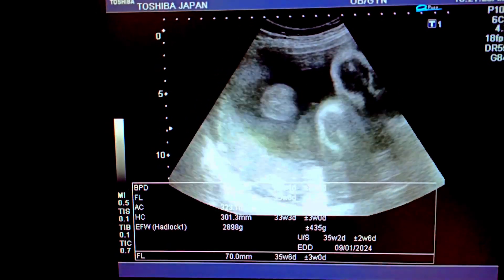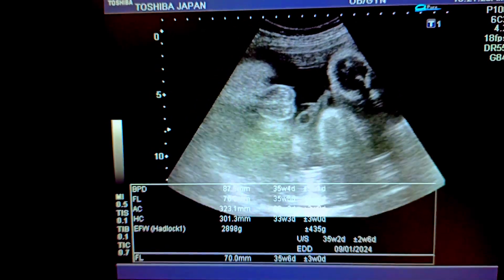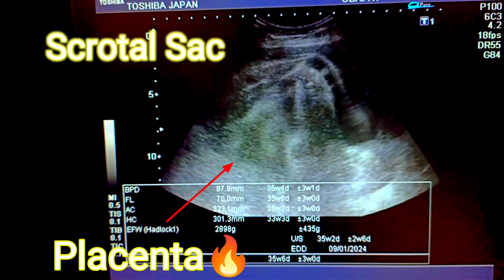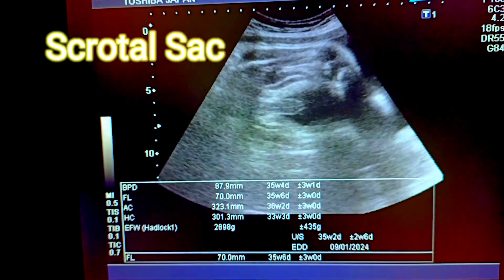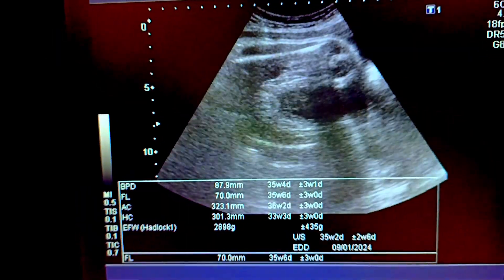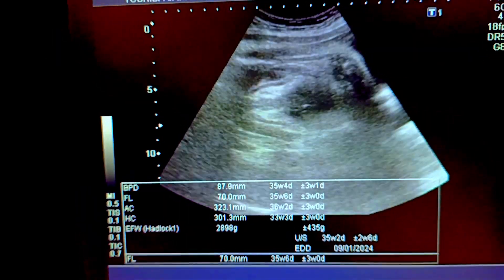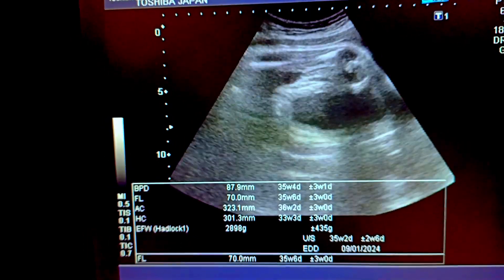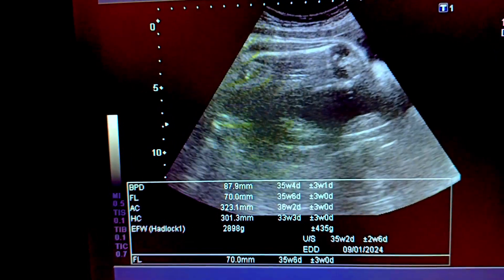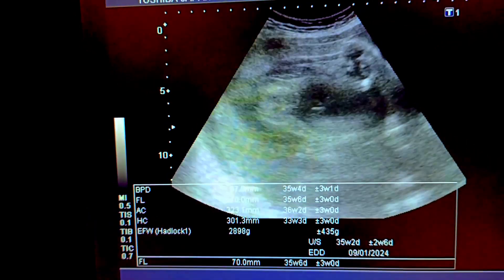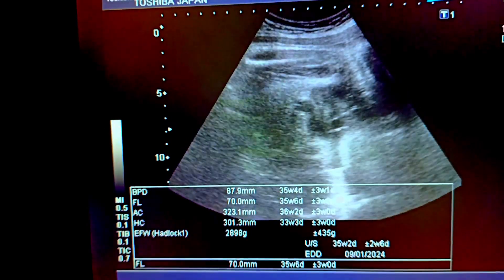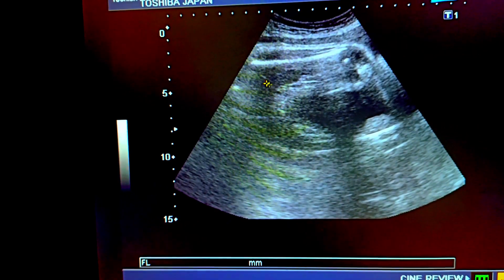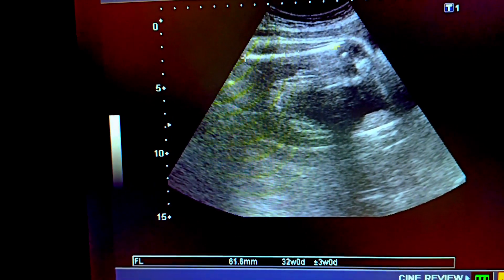This is the scrotal sac that shows the male gender. See the placenta — it is posterior fundal and it is of grade 2 maturity. These are the different parameters of the fetus at 35 to 36 weeks of pregnancy.